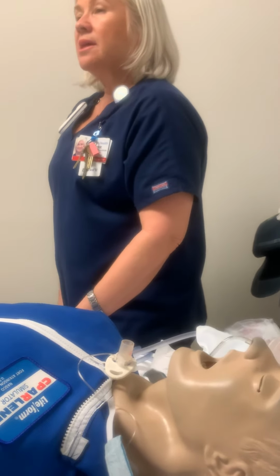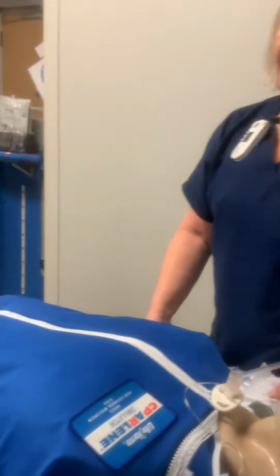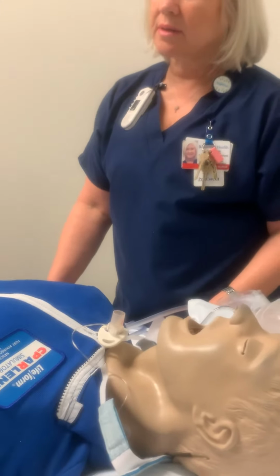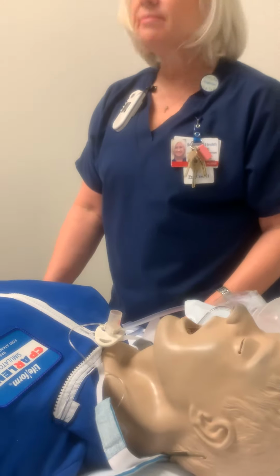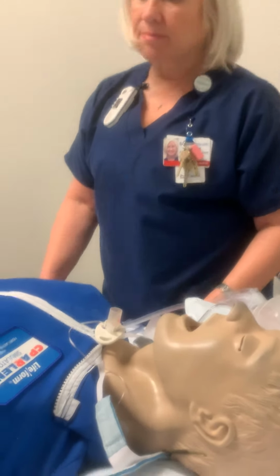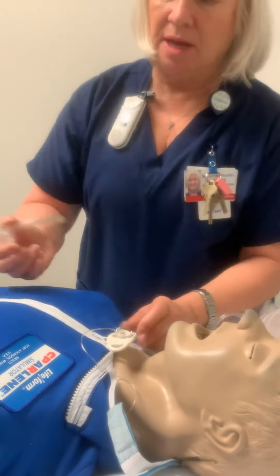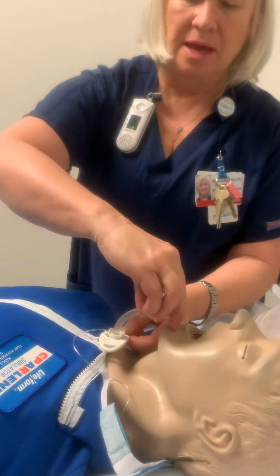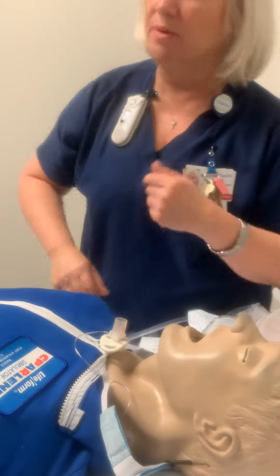And when you're taking the cannula out to clean, the whole thing's still open, so they're still able to breathe as you're cleaning. It's not like a rushed thing. Okay. No, you just take this out and you still have the hole. No, everything is fine. And then they're perfectly okay. Okay.